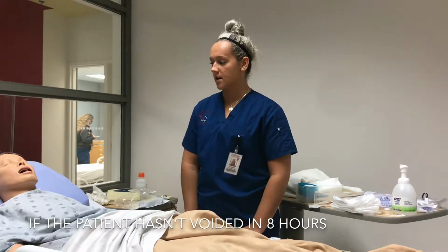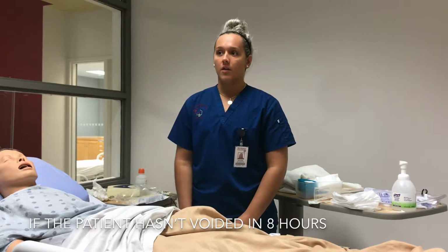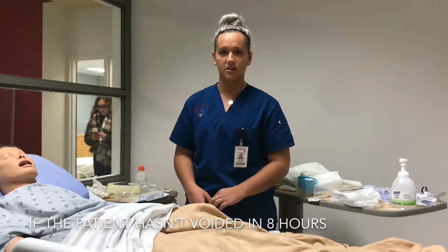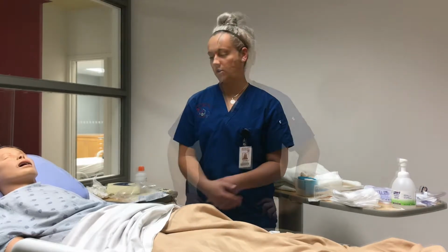So for this reason, it's that the patient is unable to void himself. So the normal amount of urine that he is unable to void is 630 milliliters. So since he's unable to void it himself, a catheter must be inserted to void the urine.